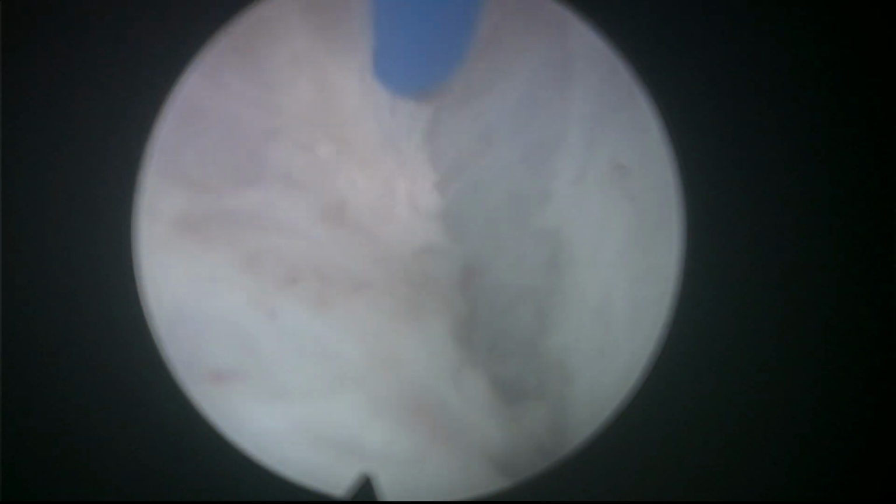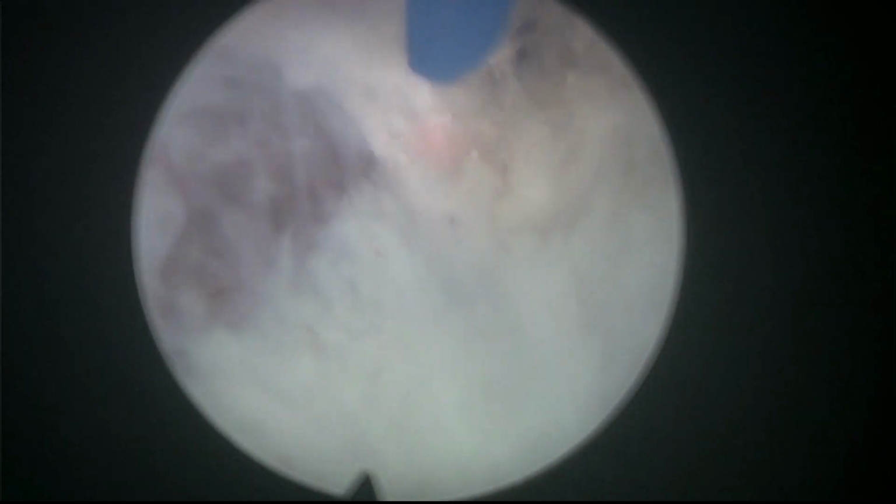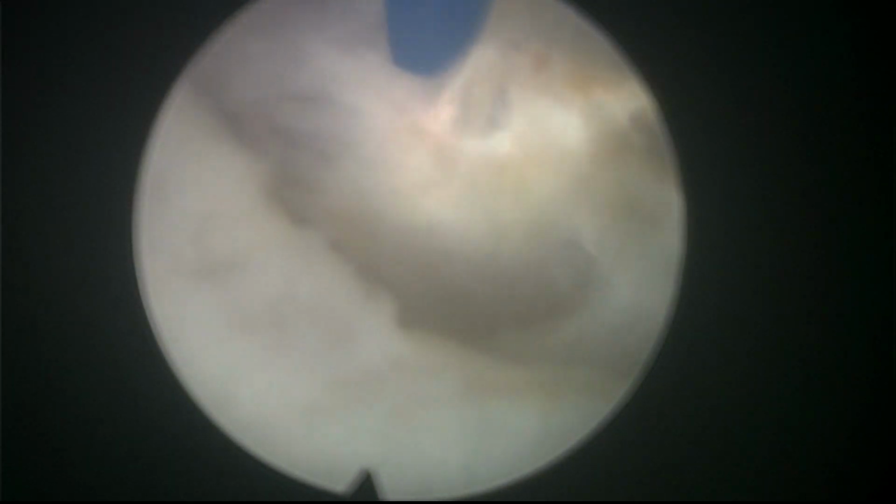Of course, you can use a normal holmium laser, but that will not have such a nice first pass coagulation effect. So you'll have to be more careful and probably go back to coagulate.